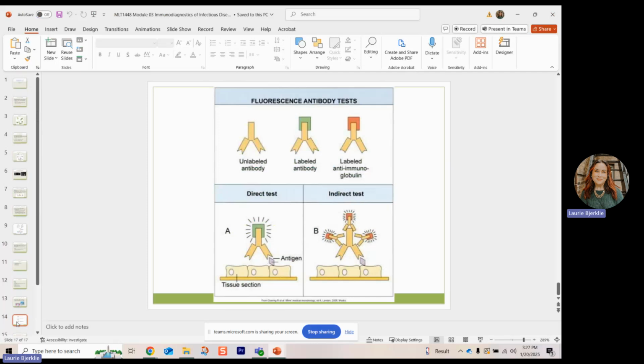Overall, we use these immunology-based methods to look for different viruses, bacteria. A lot of times they're in kits, and kits can be cheaper, easy to use. They produce a color reaction or something to tell us it's positive. But we can also see immunoassays done, like I said, in chemistry on your big chemistry analyzers when they test for different things like thyroid testing or stuff like that. They're looking for a lot of times antibodies in there. So that's where the immuno part comes in as well. Lots of different uses across the lab.